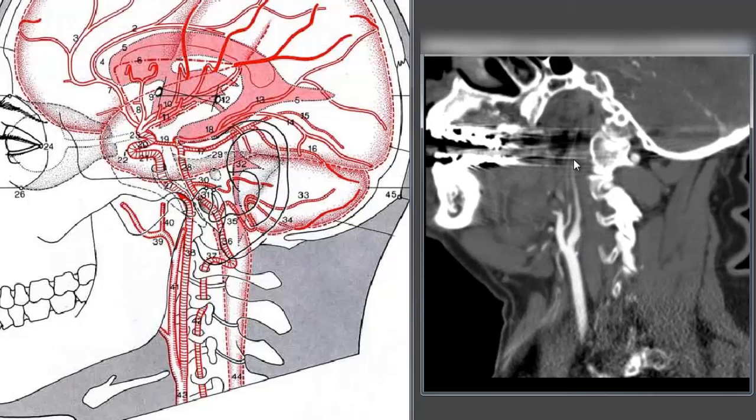The longer you wait to do your scan the more contrast opacification you would see. If you have a delayed post-contrast image you'll see hang up of contrast and more contrast opacification simply by the passage of time into that artery and that would be a way of confirming on CT angiography that in fact this is an occlusion intracranial at the terminus not a cervical internal carotid artery occlusion at its origin.